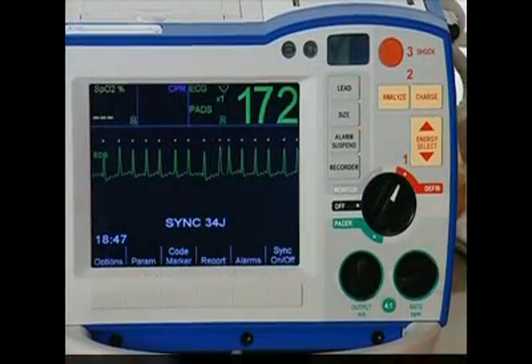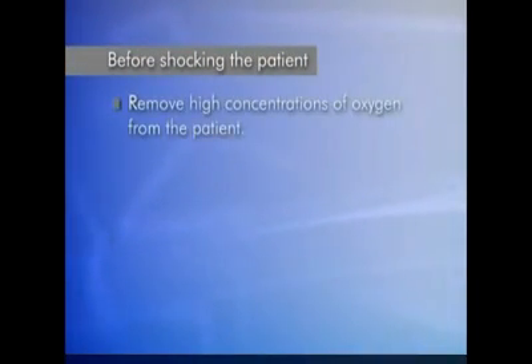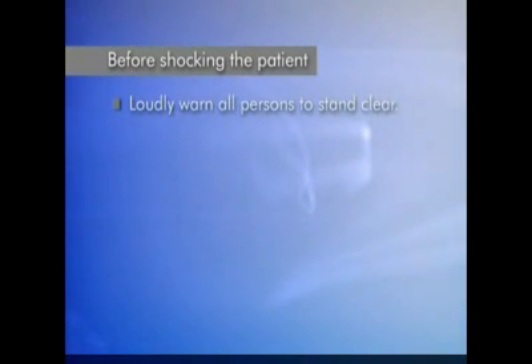Then press charge. Before shocking the patient, ensure the environment is safe for defibrillation. Remove high concentrations of oxygen from the patient. Confirm that no one is touching the patient. Look to make sure all persons are clear of the patient, the bed, and any equipment connected to the patient. Loudly warn all persons to stand clear.